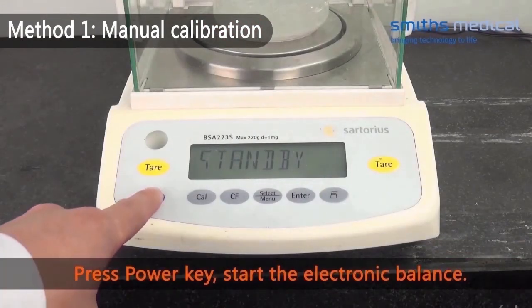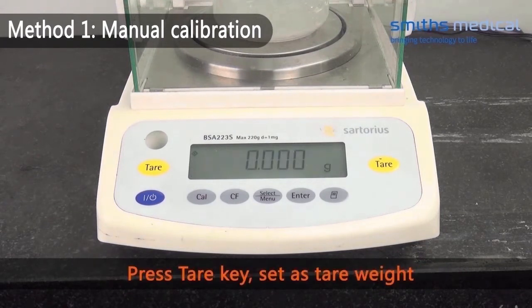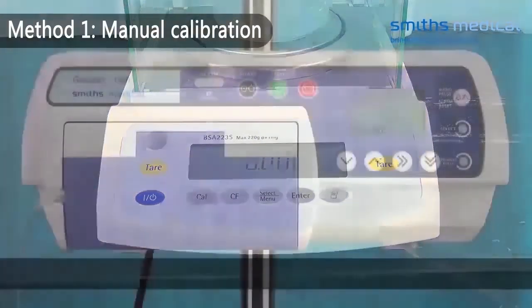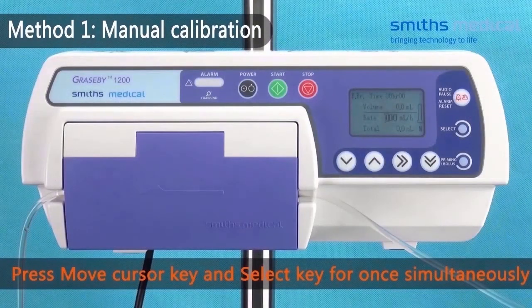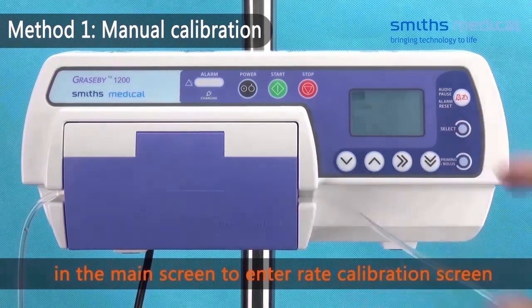Press the power key to start the electronic balance. Press the tare key and set as tare weight. Press the move cursor key and select key simultaneously to enter the rate calibration screen from the main screen.